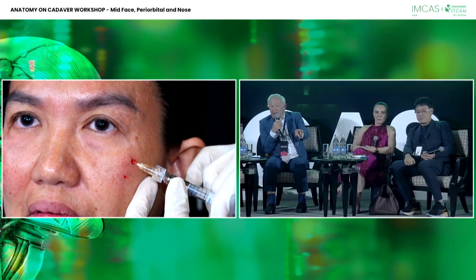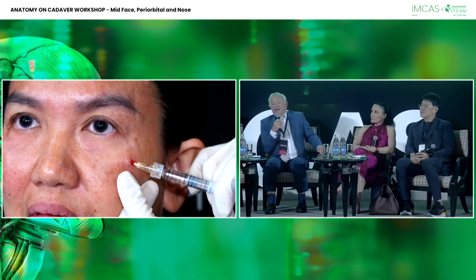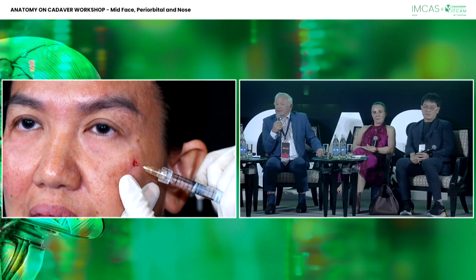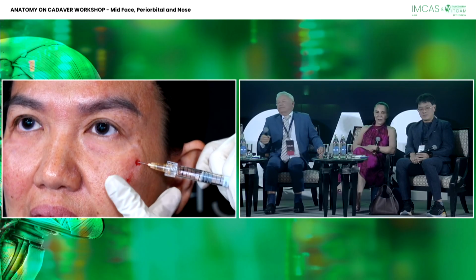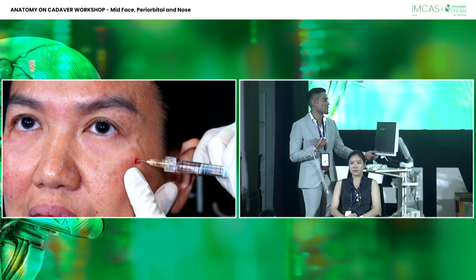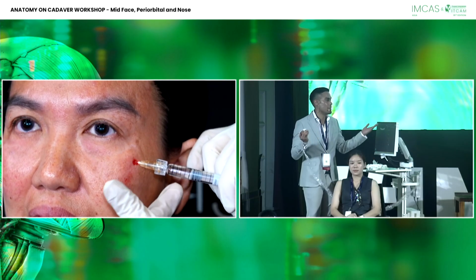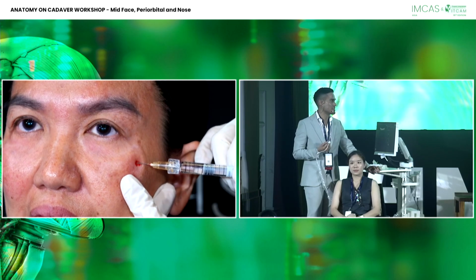And if we're looking right now, you can see the end of the cannula is actually subdermal, I think. Yes, it's very superficial right now. So that's okay if that's where you want it to be, but you should be injecting very, very small amounts, I'm sure you would agree. And the filler is not supposed to be intraorbital, right? We are not actually aiming for that, even if the patient might go away with that without problems, but that's not the point.